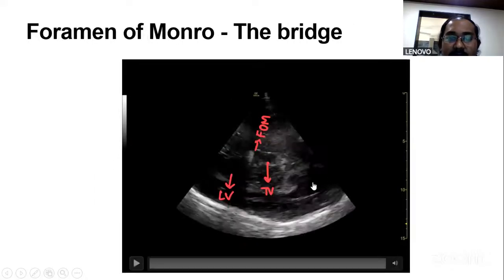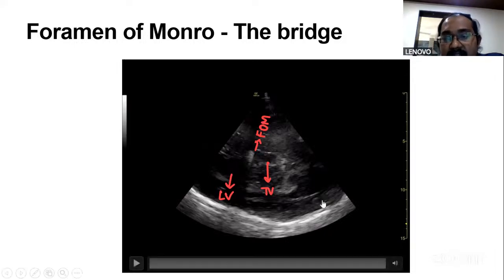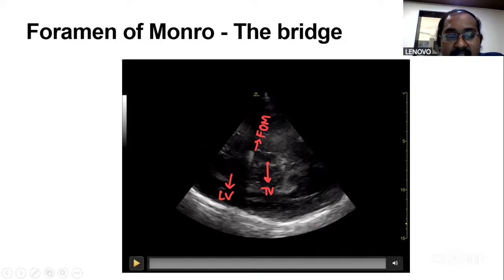So now we would like to see that the third ventricle is actually opening into the lateral ventricle. Although this is not possible in normal participants, in people where there is hydrocephalus, the anatomy is very beautiful. So here we would see that this is the third ventricle, and the third ventricle connects to the lateral ventricle through the foramen of Monro. So you can see that it is opening like hands into the lateral ventricle. You would see here.